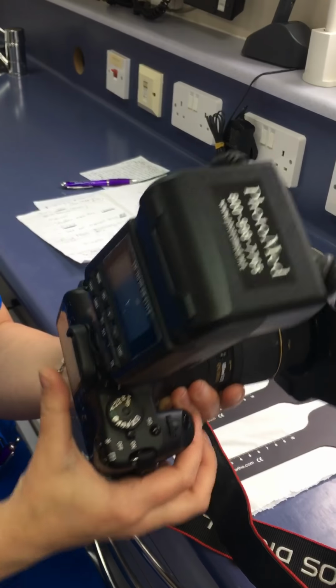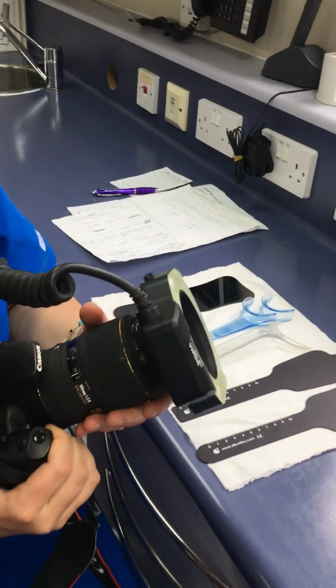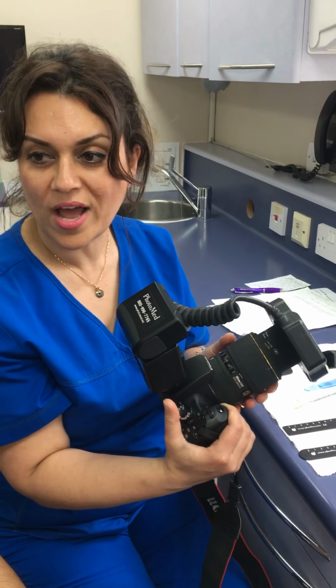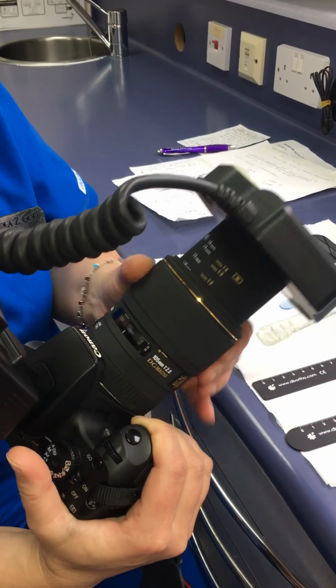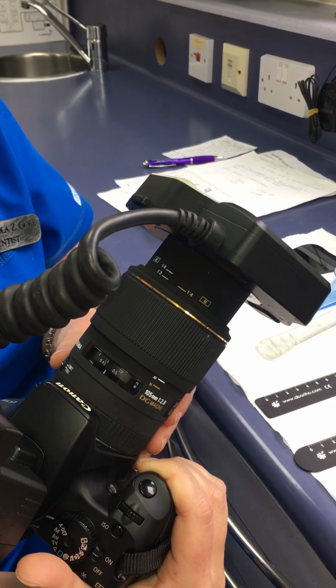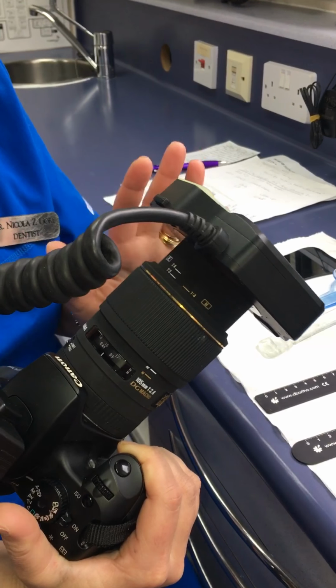When you're taking the photo, you have to make sure the magnification ratio for taking your anterior photos, your laterals, your occlusal views is on 1 to 3. So you just turn the dial like that, put it on 1 to 3 and lock it in place. That is set for taking those views which I just mentioned.